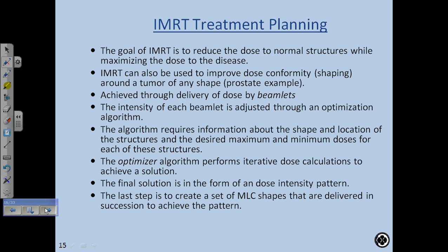Okay, treatment planning. The goal of IMRT is to reduce dose to normal structures while maximizing the dose to the disease. The advantage of IMRT over conventional 3D treatment planning, this is a new topic by the way, we're getting away from beam data. The take-home message of IMRT is not that you're going to treat the tumor better, but that you're going to spare all the OARs better. That's what it does. The advantage of IMRT is that it spares OARs. Take-home message, that's it.